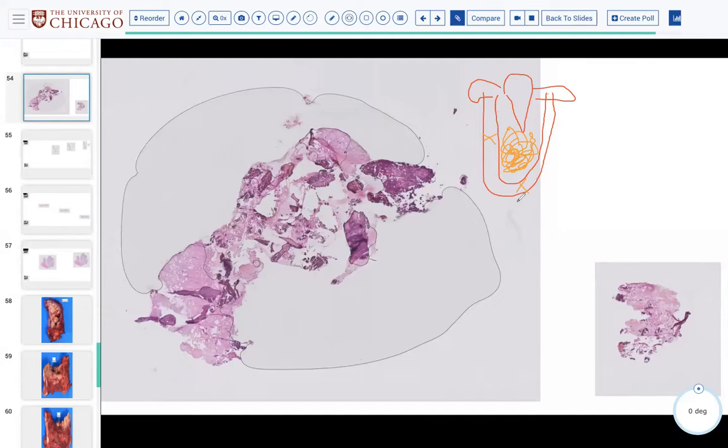But just like when they take, for example, a little tiny piece of skeletal muscle from the deep margin of a tongue, just like this for the mandible, they may only take a tiny little portion of the face of that mandible that's not really representative of this whole surface. And so that's what I want to show you guys here. So this is a little speck, right?